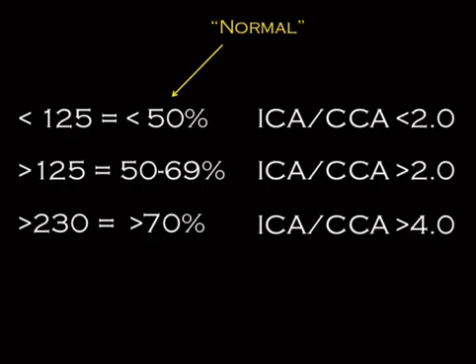Now here's a second trick that you could end up with. There's a couple of different tricks with regard to numbers. So here would be some trickery that you might want to watch out for. These numbers are in centimeters per second, okay? Not meters per second, not millimeters per second, not millimeters per minute, centimeters per second. So there could be a degree of trickery that occurs with those numbers in a deliberate attempt to trick you.